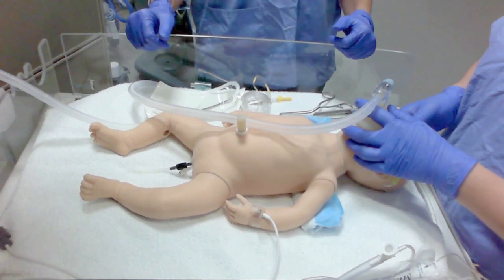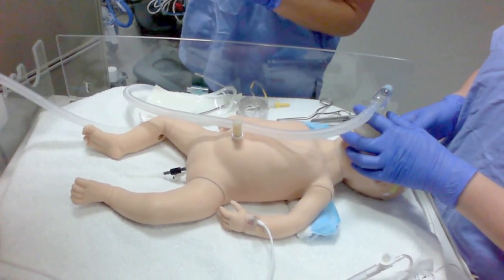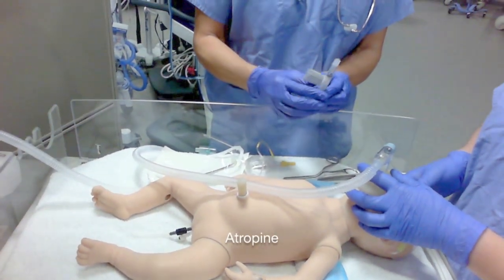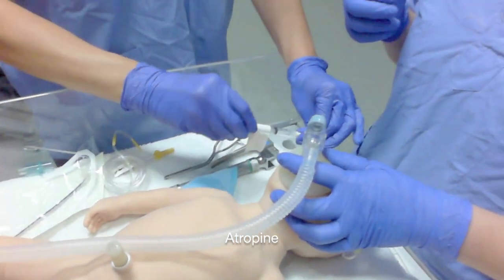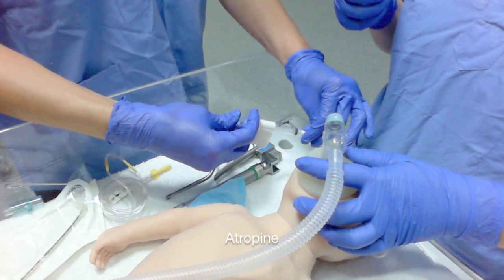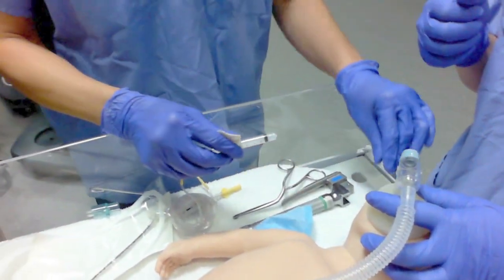Now that everybody is ready, it is time to administer the medications. Ensure your patient is on full cardiorespiratory monitoring and that these remain stable throughout the procedure.